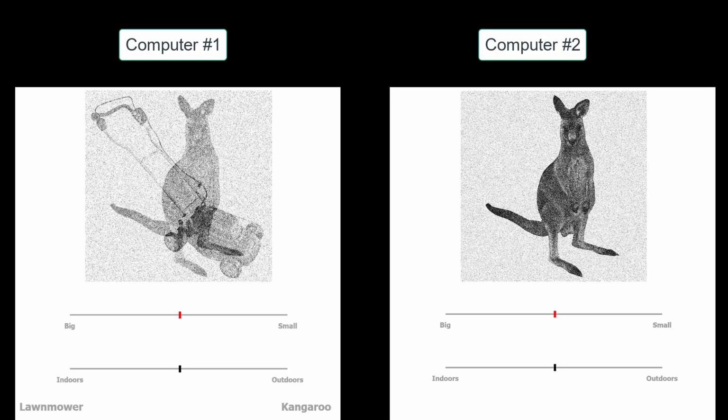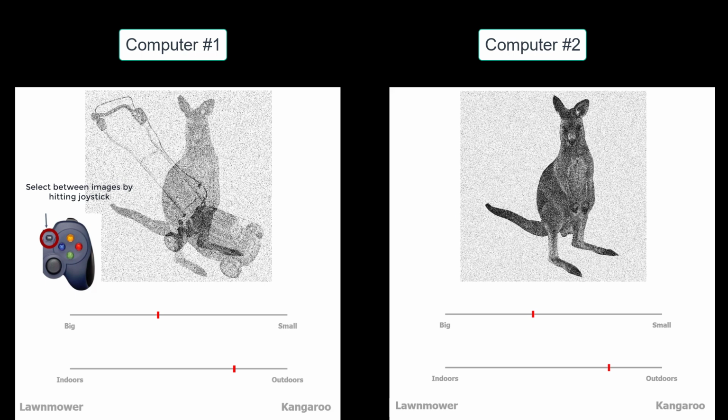BCI 2000 Hyperscanning introduces a multiplayer gaming architecture that leverages a central server to keep game states synchronized across several local clients in different locations, while also capturing and aligning neural and behavioral data from players. This setup facilitates research into brain-to-brain interactions and synchronicity among multiple participants.